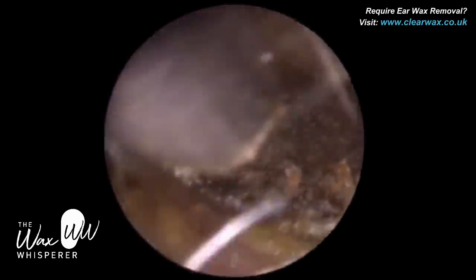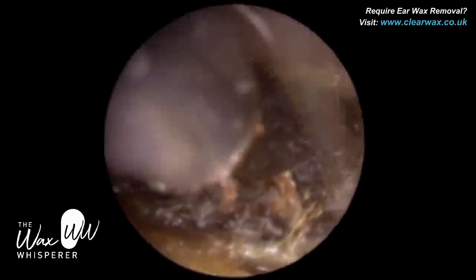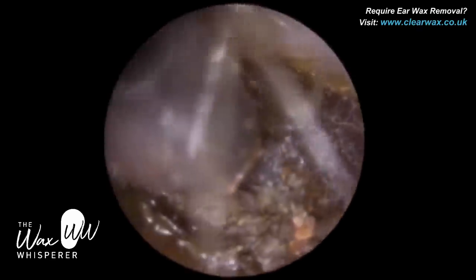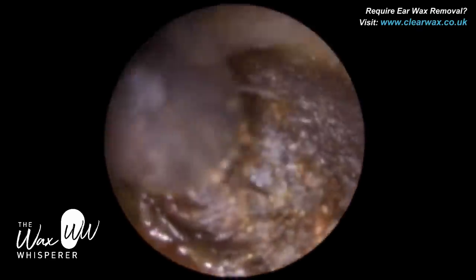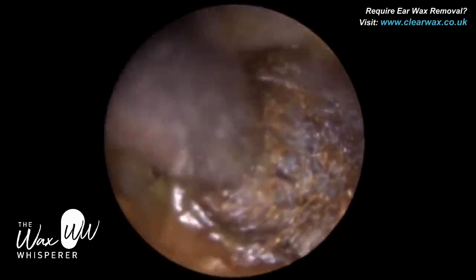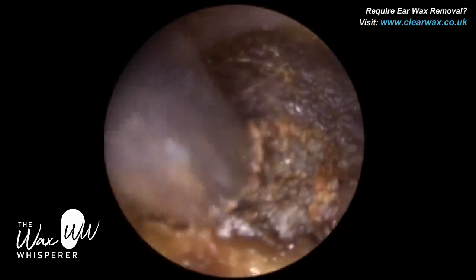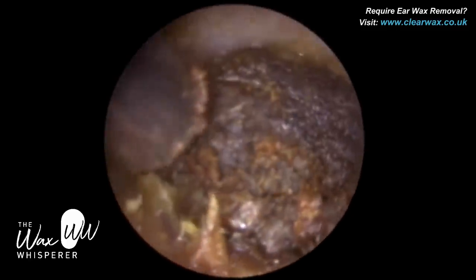The drops they used — this part here — the patient was just talking. So when patients talk their jaw moves. I was just waiting for the patient to stop and then I proceeded to enter the ear with the instrument, because I didn't want to make contact with the canal wall while they were talking as that can be very uncomfortable.